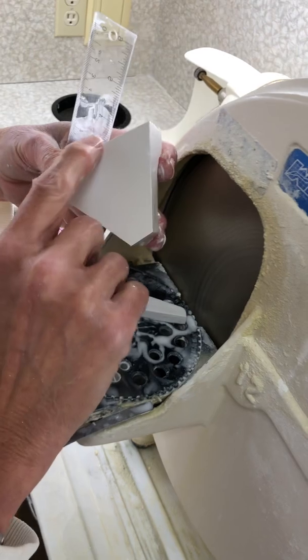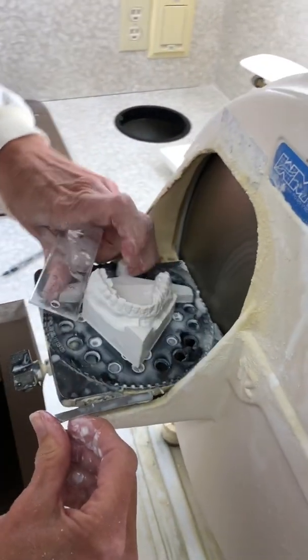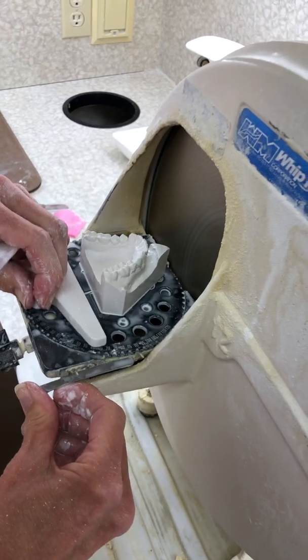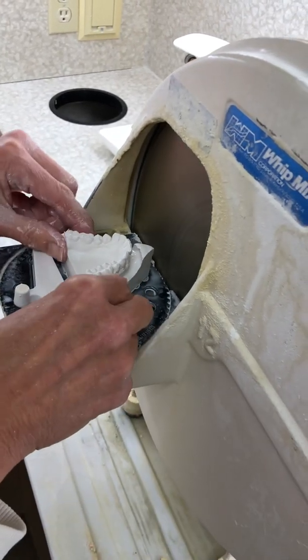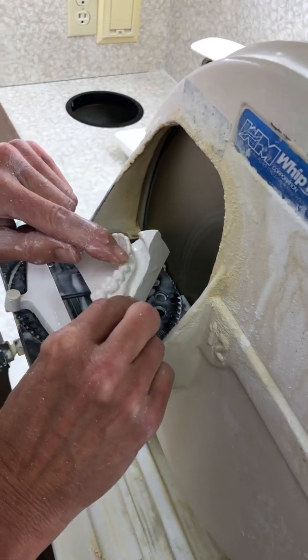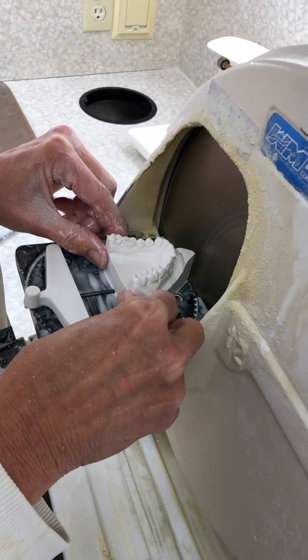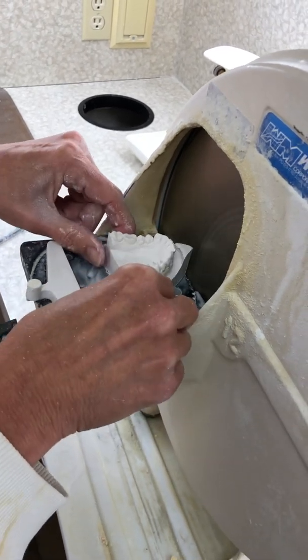What we have to do now is that curvature across the front. So it runs from cuspid to cuspid, and it's just basically eyeball. Everybody likes them a little bit different. We usually try and follow the same curvature as the teeth. All right, so we'll just kind of go straight in and then rock it.